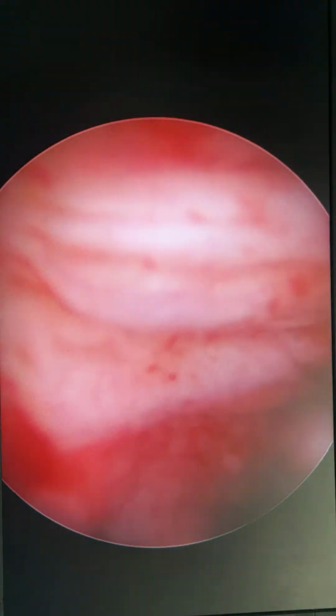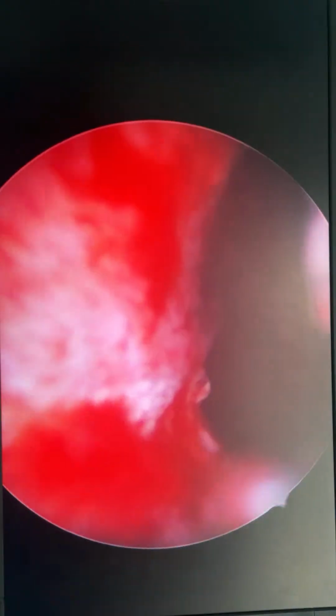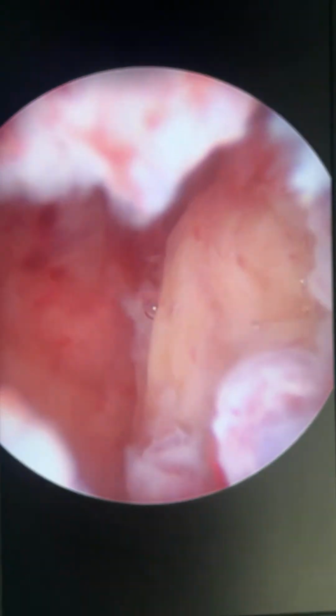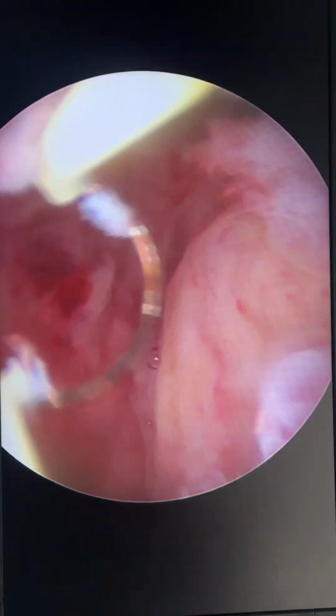Yeah. So now after removing the pieces we had dissected, we are just simply going in to do a check inside. So gradually, as we make our way, now we see still a lot of contents there. So first we will remove them and then we will go for the resection of the niche as we see. So here it is.